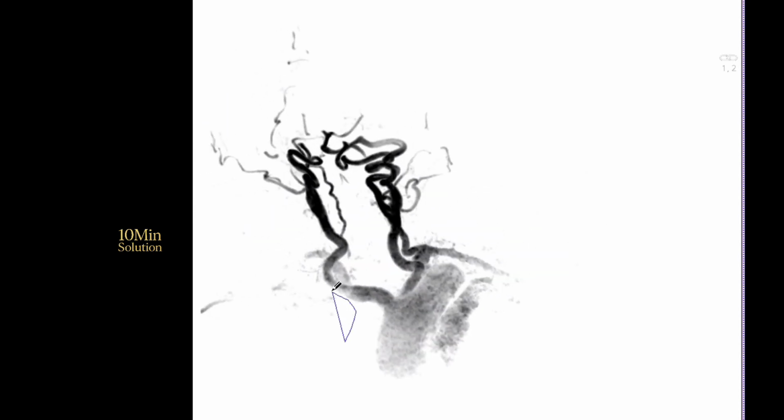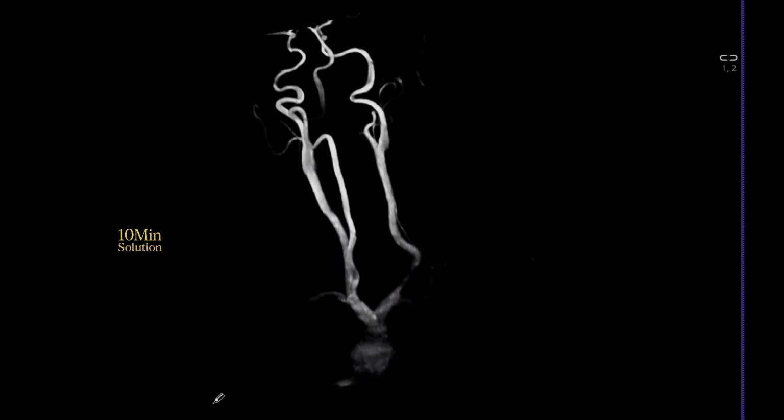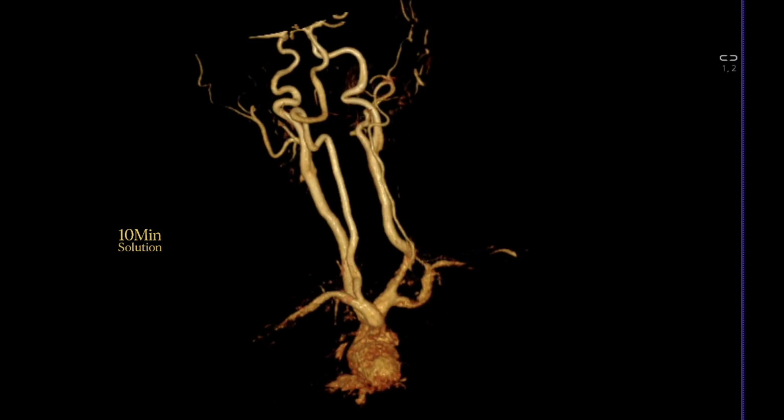Protocol setup. There are mainly 2 techniques used in MRA of neck vessels: time-of-flight MRA and contrast-enhanced MRA. Time-of-flight MRA relies on flow-related enhancement and does not require contrast. It is useful for patients where contrast is contraindicated. CE MRA provides better visualization and faster acquisition using gadolinium contrast.